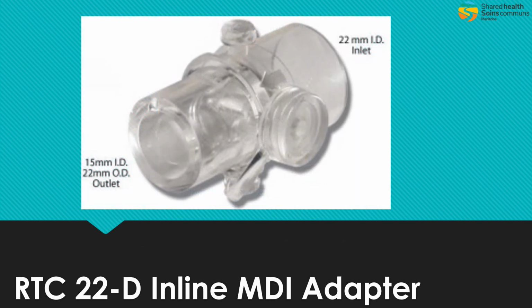The device itself has two different outlets. One side has a 22-millimeter interior diameter inlet, so this is where our BVM actually hooks up to it. On the other side of the device, we have a 22-millimeter outer diameter, so that it fits into our BVM masks. It also has a 15-millimeter internal diameter, so that it fits nicely and snug onto our iGels.